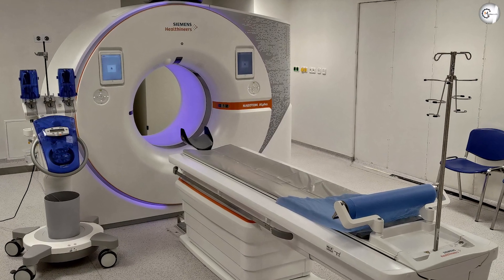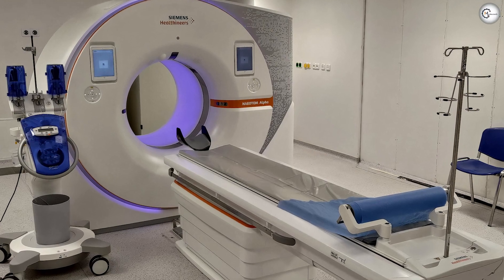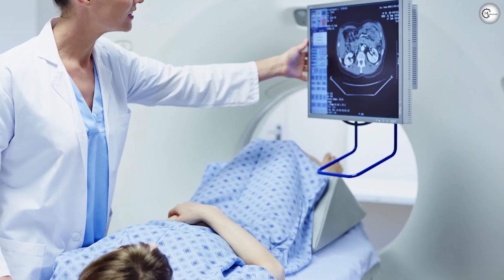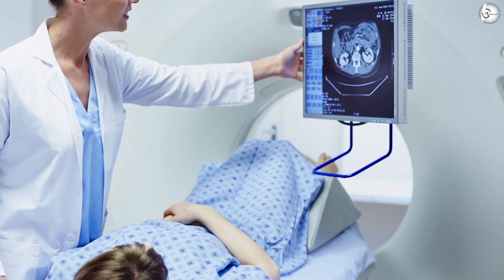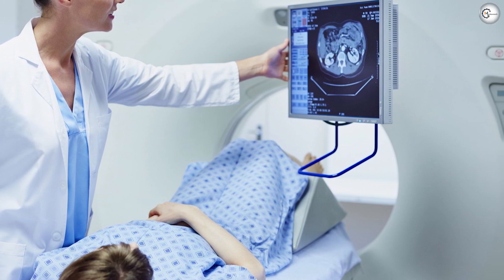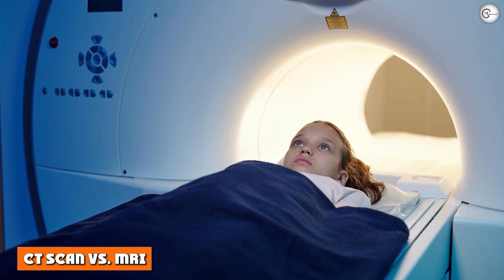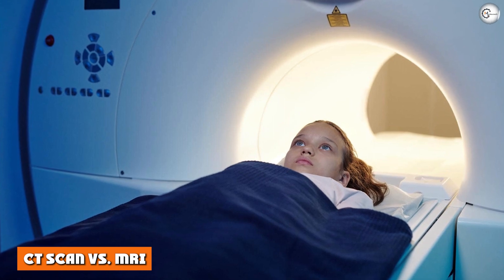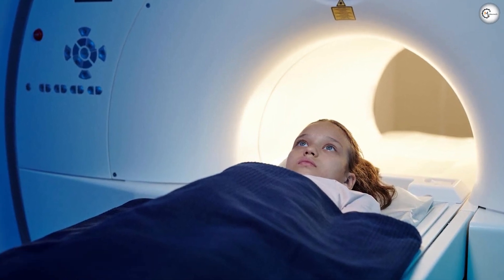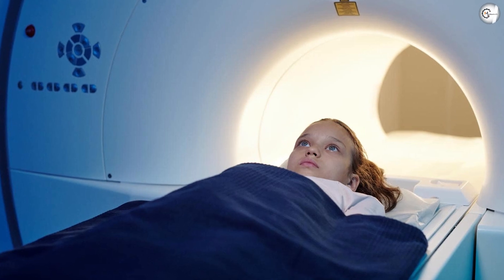How a CT scan works: CT, computerized axial tomography, uses x-rays to generate images of the body, including bone. In the CT scanner, the x-ray tube source rotates around the patient lying on the table. On the opposite side of the patient from the tube is the x-ray detector, which receives the beam that passes through the patient.